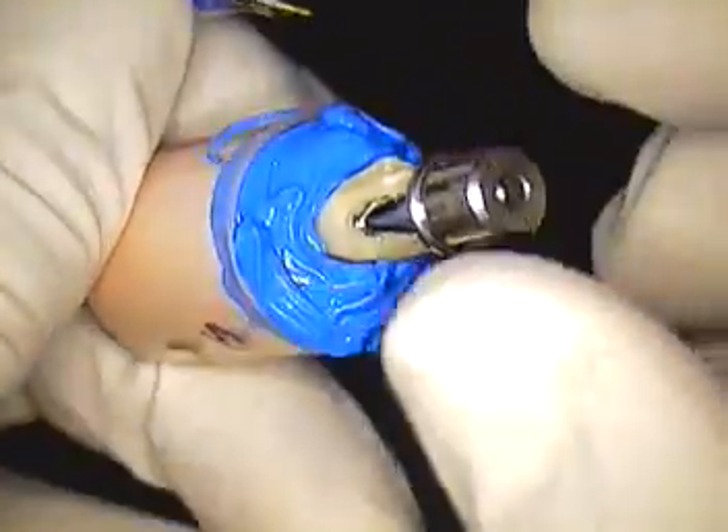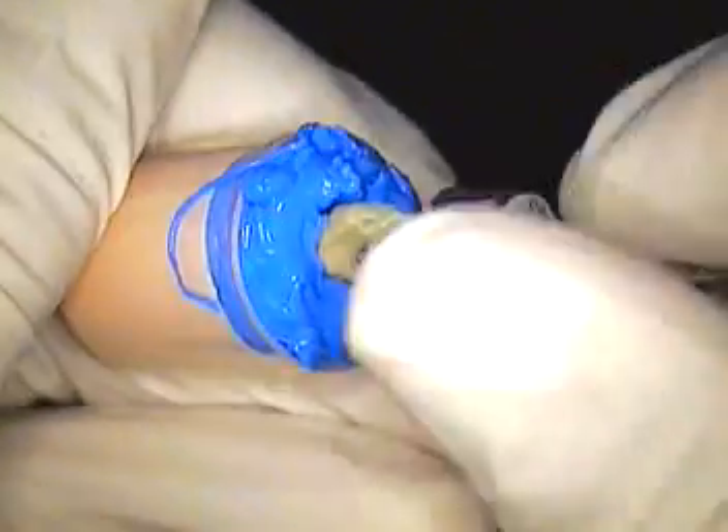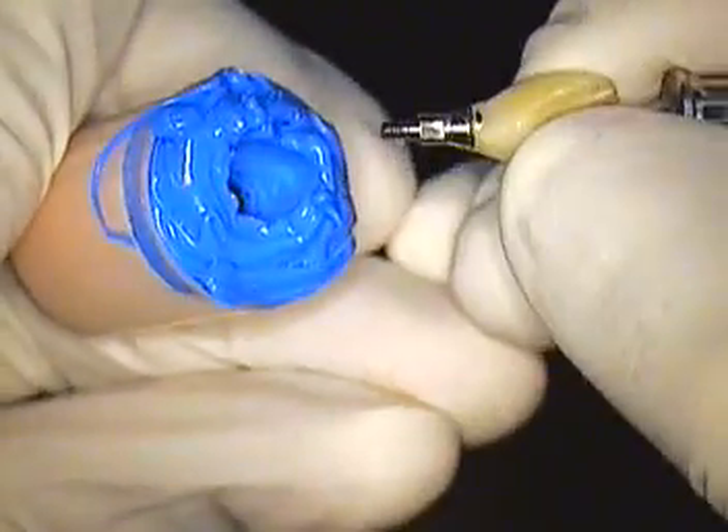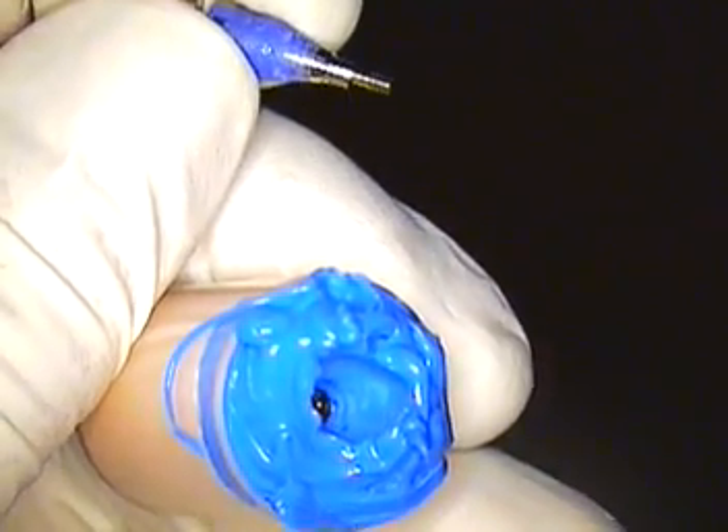Hello, and we're back. This is Dr. Jerry Cuomo. I'm here with the bone-level case, cola-coated yellow, and we now have the jig ready. We're about to take out the tooth, temporary abutment, and temporary crown.